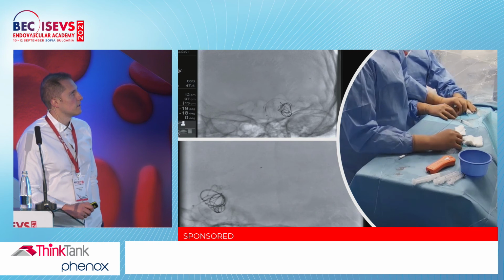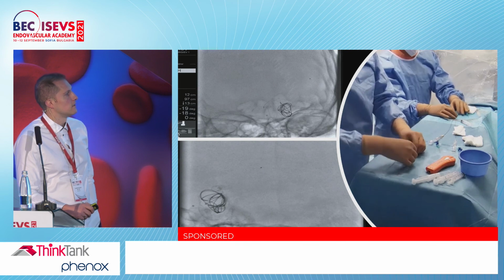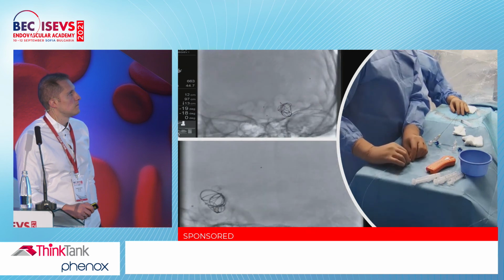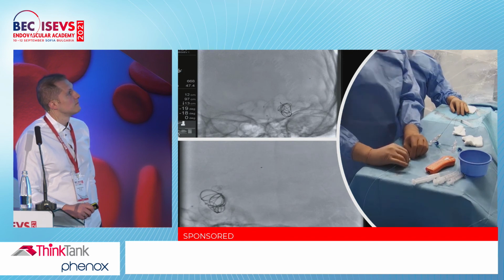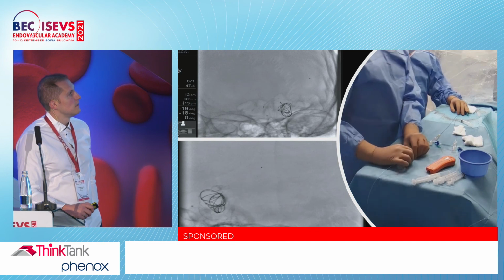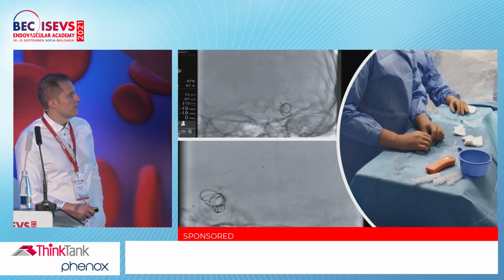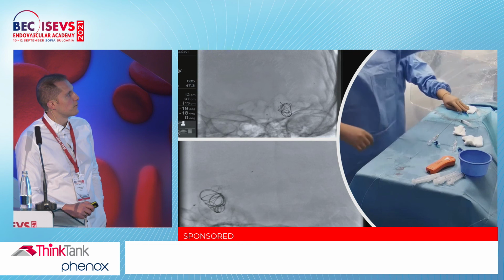So we now remove the microcatheter for the coiling. And now is the time to see these markers becoming 8. Here. You see the stent? Just apply some tension, and the stent is opened. It becomes like a sleeve. On the lateral view, you can see it here. You see the markers? So they are completely opened to the nominal diameter of the vessel.